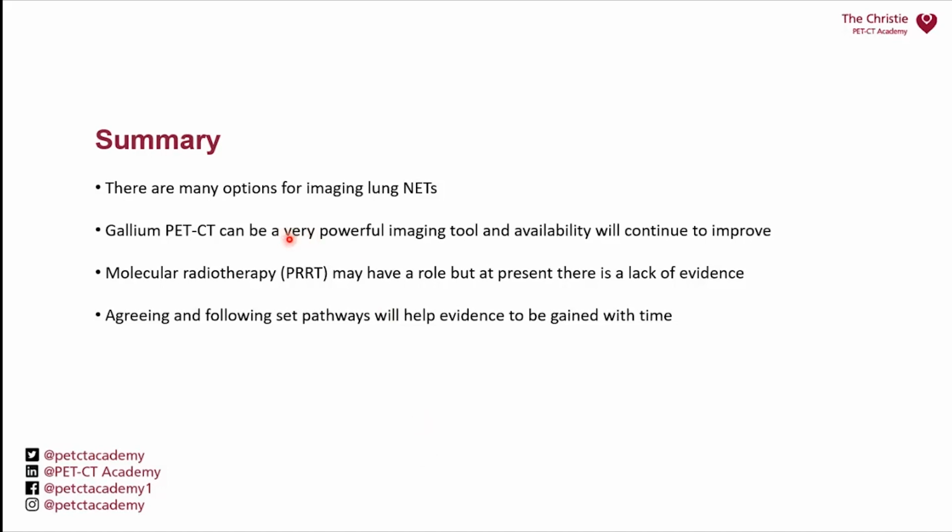Gallium PET-CT in particular can be a very powerful imaging tool for neuroendocrine tumours, and the availability, whilst at the moment patchy through the country, will continue to improve, and we're all in my field of medicine working to try and improve that.